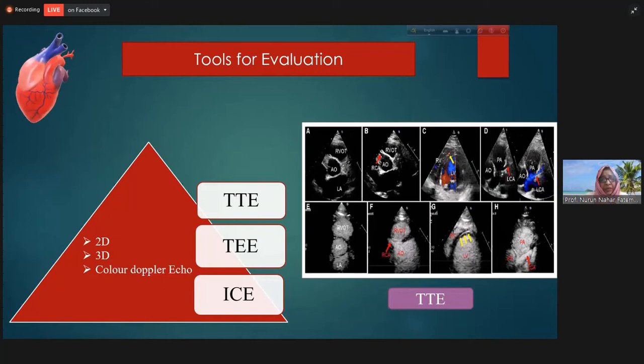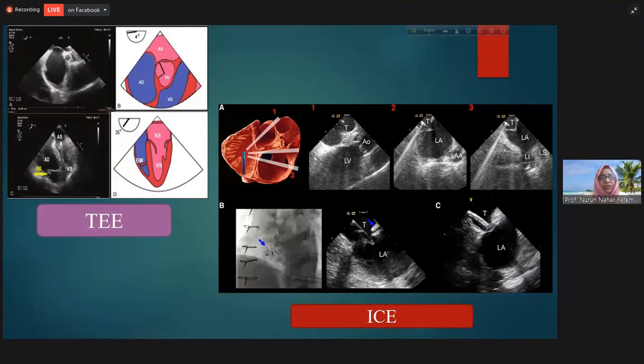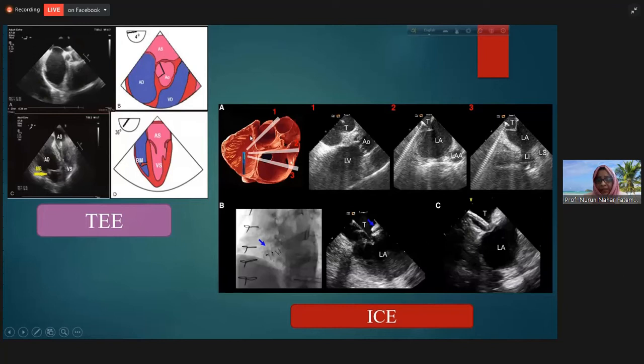We evaluate with transthoracic echocardiography, transesophageal echocardiography, and intracardiac echocardiography (ICE). The image quality of transesophageal and intracardiac is almost similar. With TEE, the probe is inside the esophagus; with ICE, the probe is directly inside the right atrium in very close proximity to the atrial septum. ICE requires no general anesthesia because the probe is introduced just like a catheter.